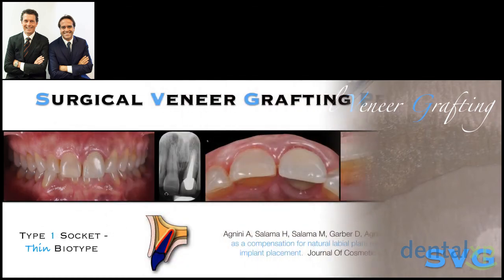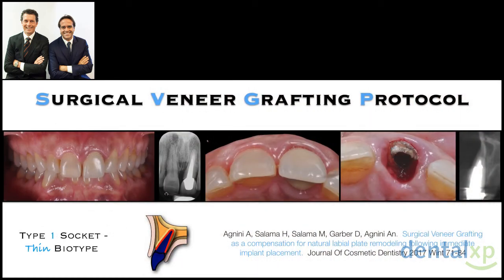So as with each technique that we discussed, the surgical veneer grafting also has a specific, standardized protocol that must be followed step by step, and this is what we're going to do while presenting this case. Look, this patient with a high smile line, with a failing left central incisor due to a palatal fracture, who complained about pain and mobility of number 9 and a diastema, which he wanted to preserve.